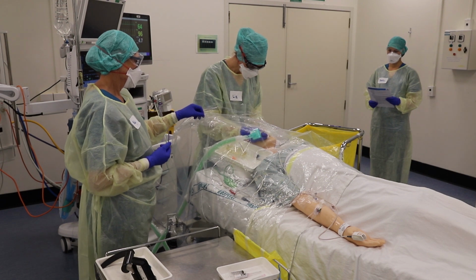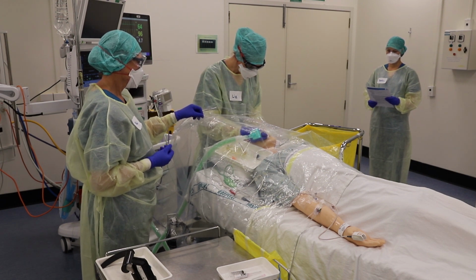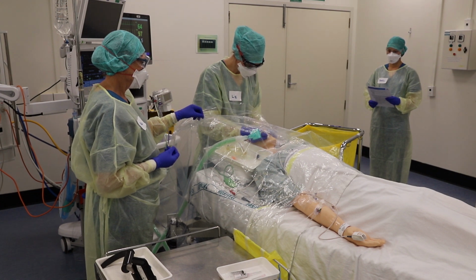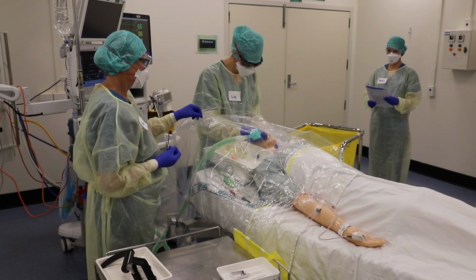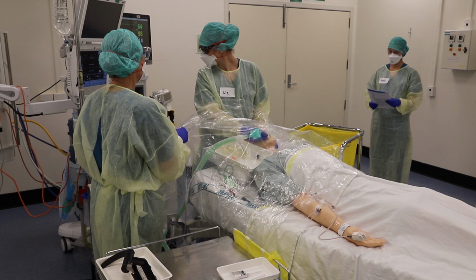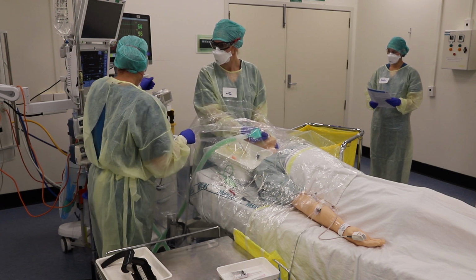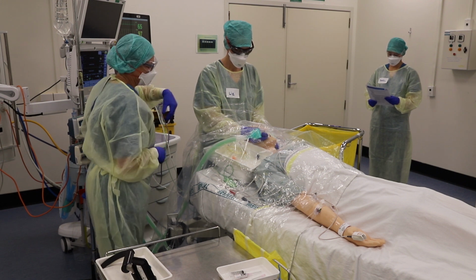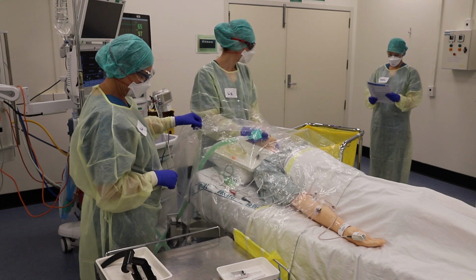Simon? Simon, can you open your eyes for me? Simon, open your eyes. Okay, so we'll turn the ventilator off now. Can you check the APLs open? Ventilators off. APLs on minimum. Perfect, thank you. We've done that, Celine.